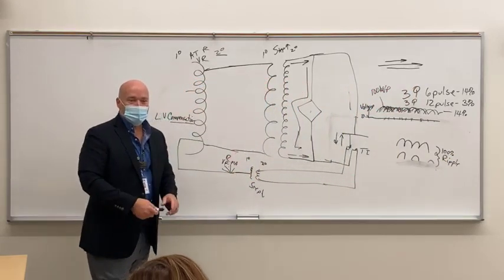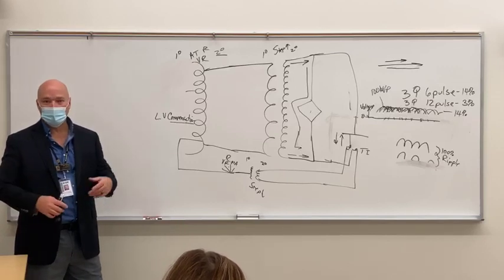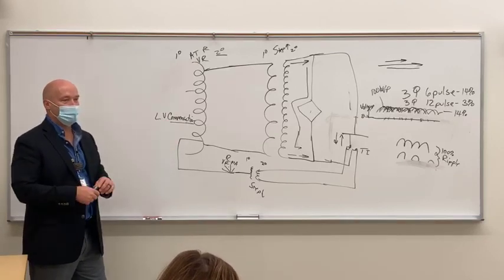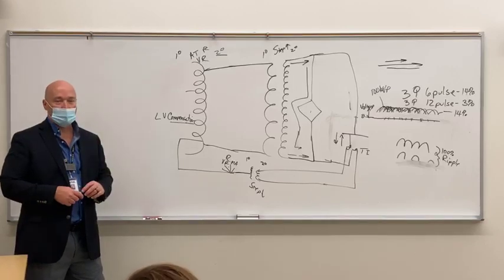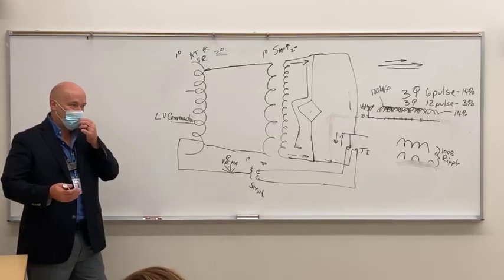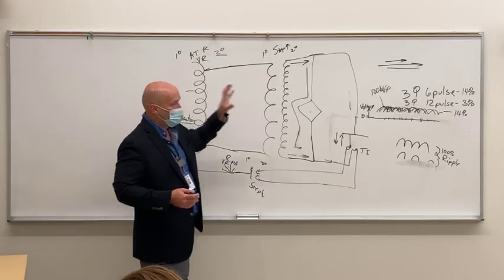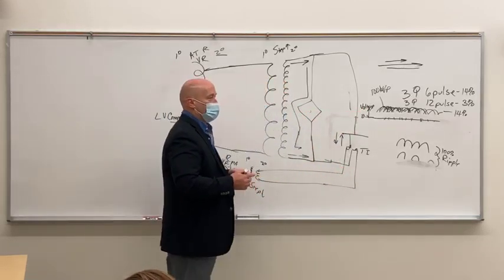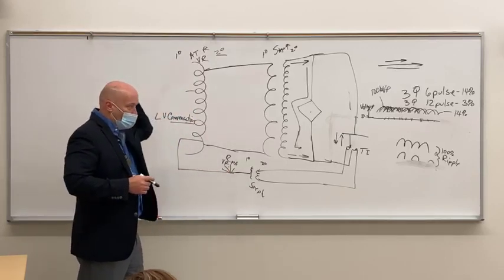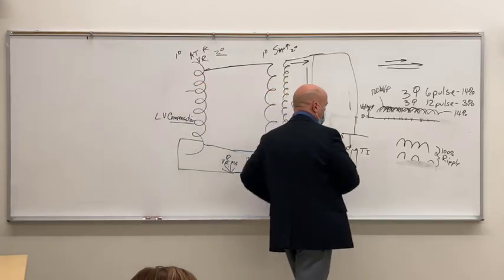And it's still not enough for somebody. That was enough for me, but it wasn't enough for somebody. So somebody came out with what they call a high frequency generator. A high frequency generator does all that stuff, but it runs it through another circuit that, as I understand it, how it works is like this.